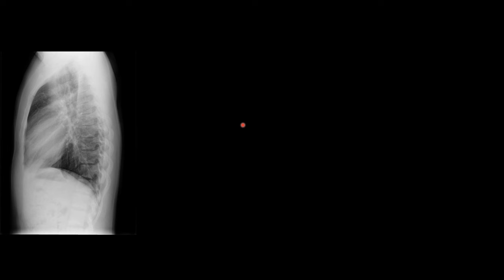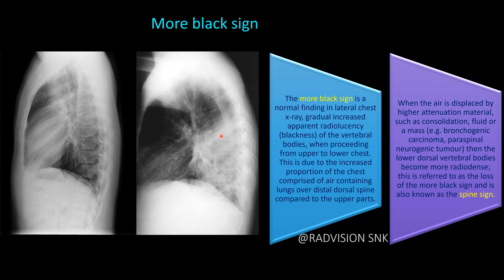Next case: on the lateral chest radiograph, the lower half of the thoracic vertebrae are more lucent compared to the upper half, because the lower half is superimposed with the lungs whereas the upper half is superimposed with soft tissues and the humerus — this is the 'more black sign.' However, whenever there is loss of lung lucency due to consolidation, collapse, effusion, or even a mass in paraspinal locations, that lucent zone is lost — this is called spine sign positive. Remember: spine sign positive in consolidation, effusions, bronchogenic carcinoma, and paraspinal neoplasms such as neurogenic neoplasms.